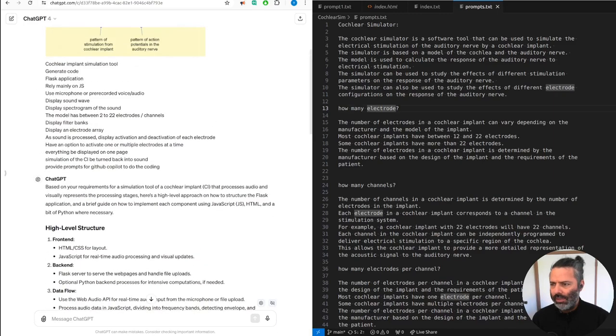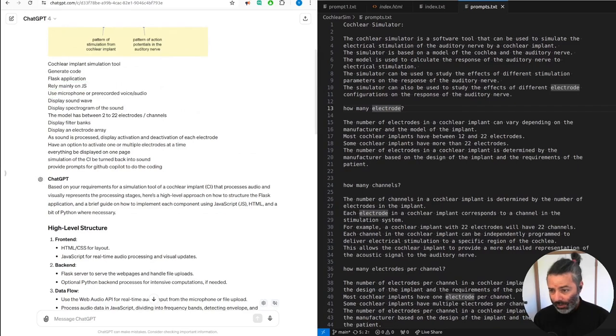Yeah, we're doing cochlear implant simulation, generate code. The Flask application relies mainly on JS. We want to, just to save some electricity cost, use a microphone. Or you can either use a microphone or have a pre-recorded voice or audio being processed by the cochlear implant. Display sound wave, display spectrogram of the sound.